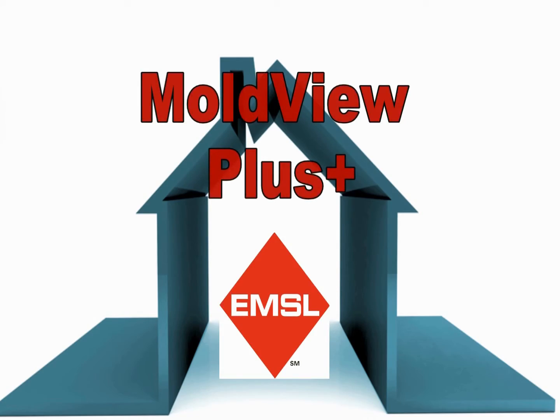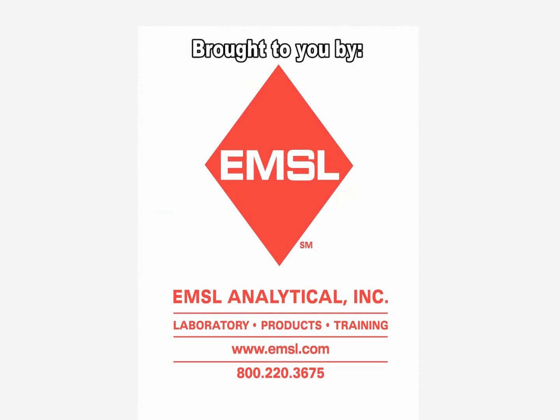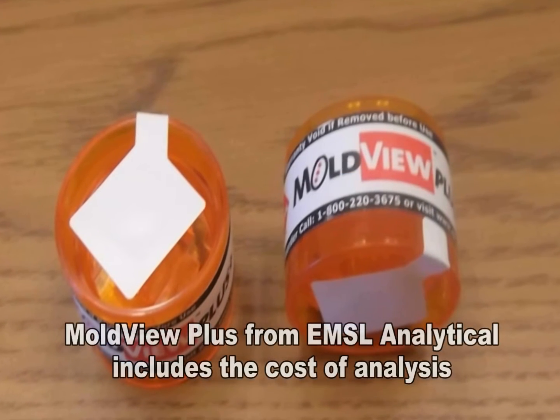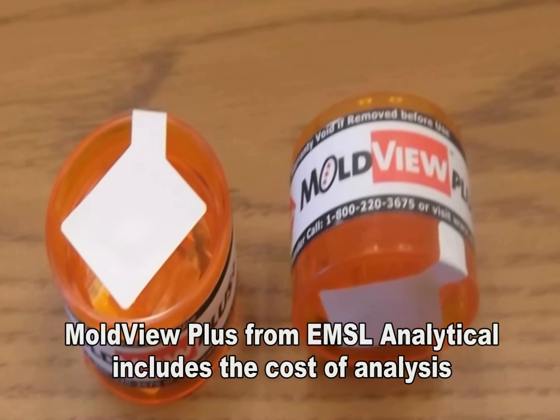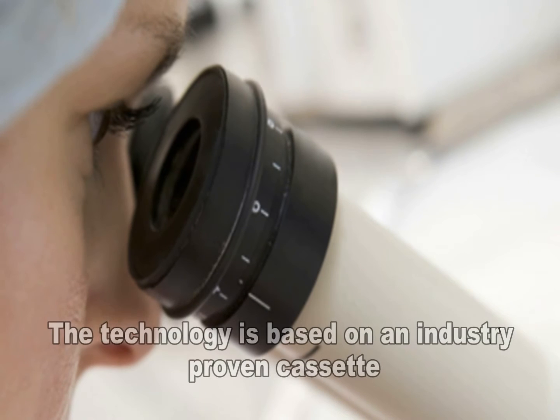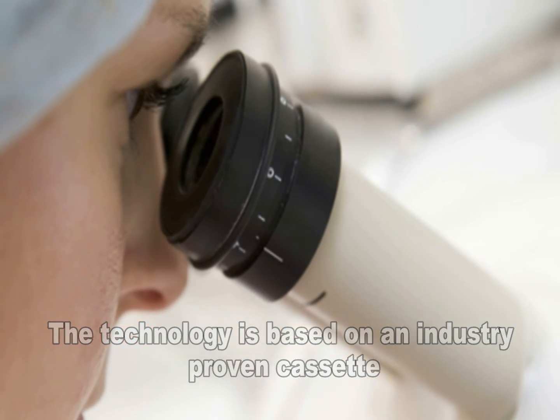Welcome to EMSL's product videos. The MoldView Plus is a unique air sampling cassette which includes the cost of laboratory analysis at EMSL Analytical. It is based on an industry-proven cassette that has been designed for the collection and analysis of a wide range of airborne contaminants.